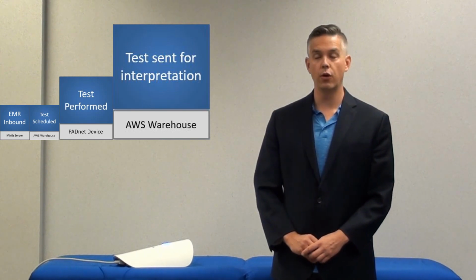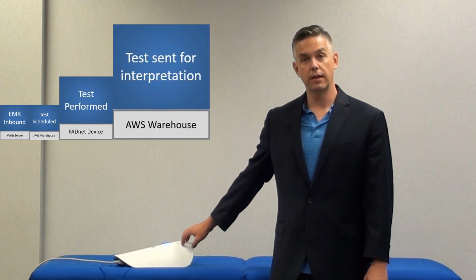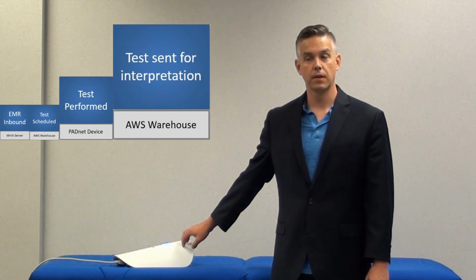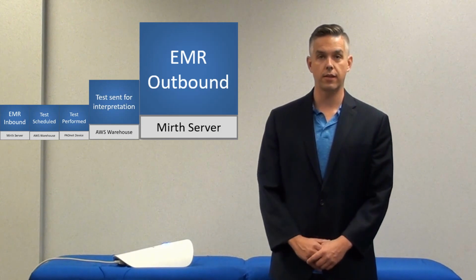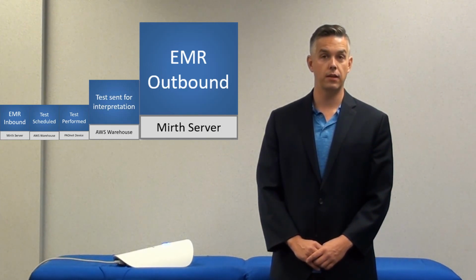Keep in mind that although data is encrypted on the device, once the data is sent to the cloud, it no longer resides on the device. In addition, once the test is interpreted, you can use an HL7 interface to move the interpreted test data back into the cloud, or you can send it into your EMR through an HL7 interface.